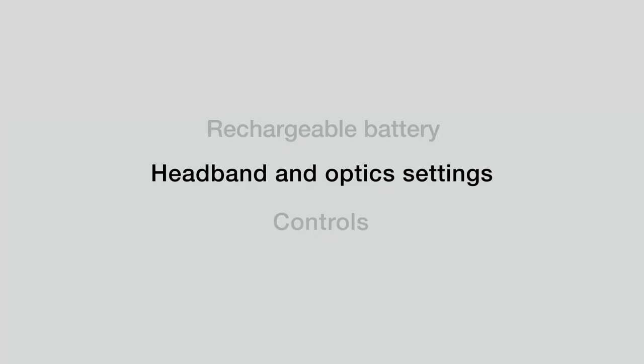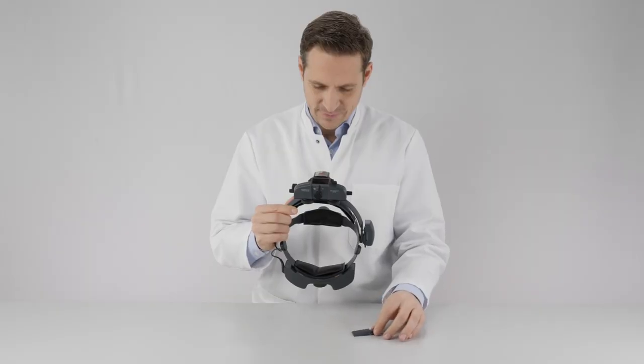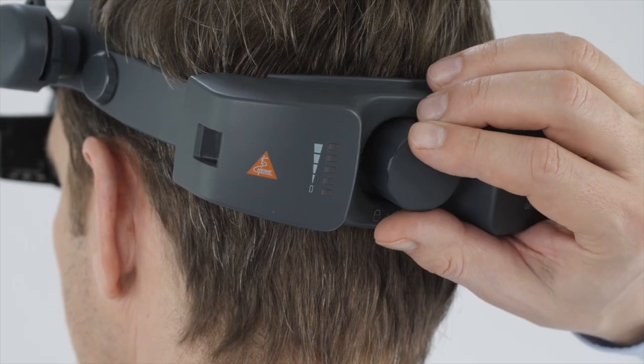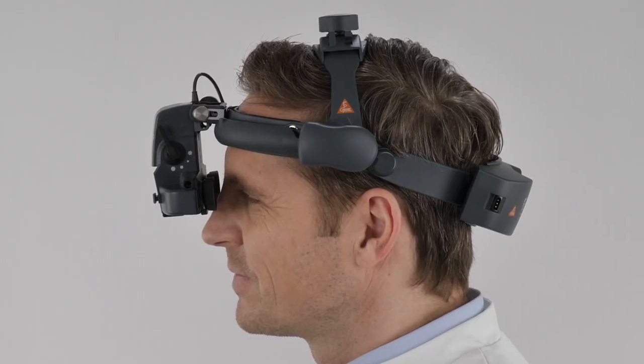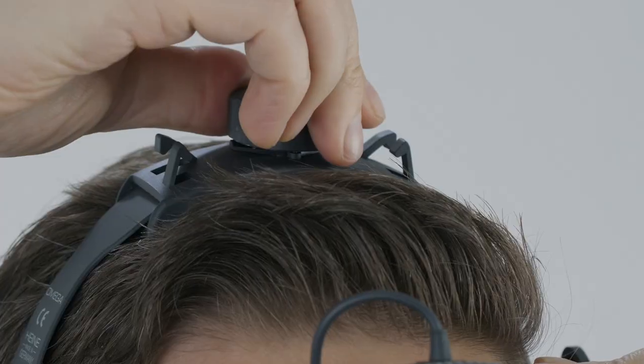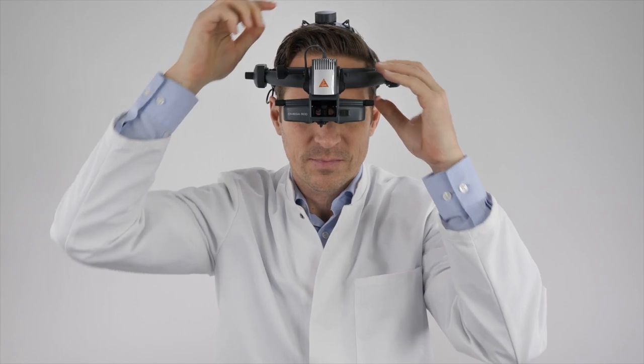The next chapter: headband and optics settings. First, remove the protective cap. There are two large knobs on the headband. With the rear knob, you can set the head's circumference. The battery should be placed slightly downwards. With the upper knob, the height can be adjusted. The headband should sit firmly but comfortably.